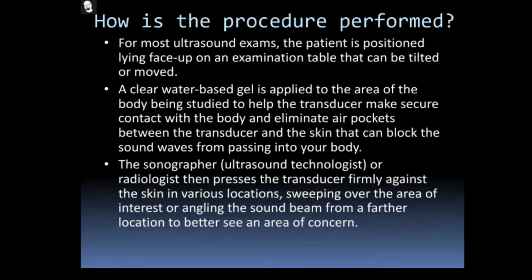How is the procedure performed? For most ultrasound exams, the patient is positioned lying face up on an examination table that can be tilted or moved. As with CT, X-ray and MRI, the patient table can be tilted or moved in any direction. A clear water-based gel is applied to the area of the body being studied to help the transducer make secure contact with the body.